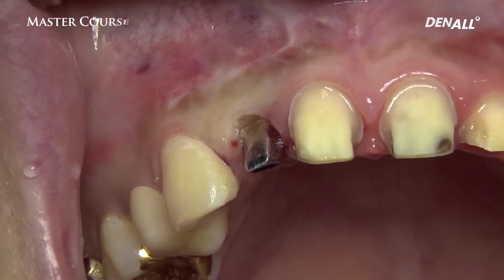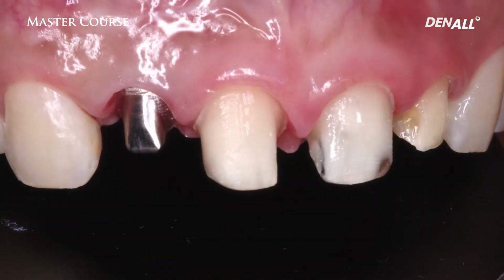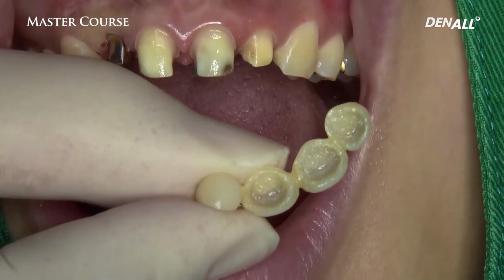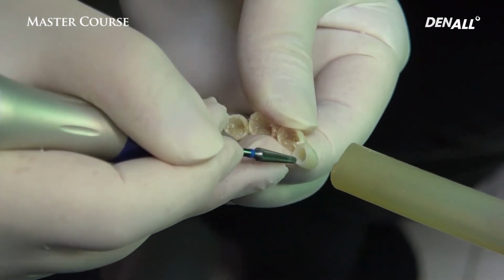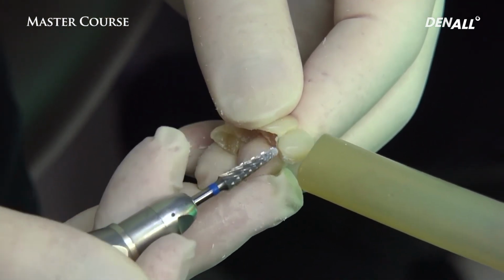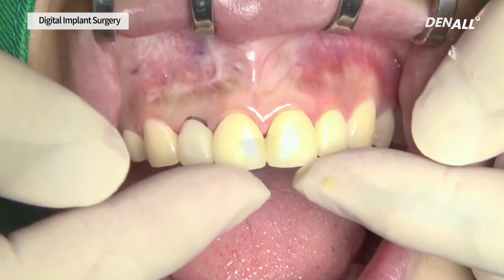Initial stability of 20 Newton or more is achieved for the implant. It looks as if the tooth is prepared, and the abutment appearance looks really beautiful. After that, the cantilever splint crown used by the patient before is mounted after the inside is reduced.